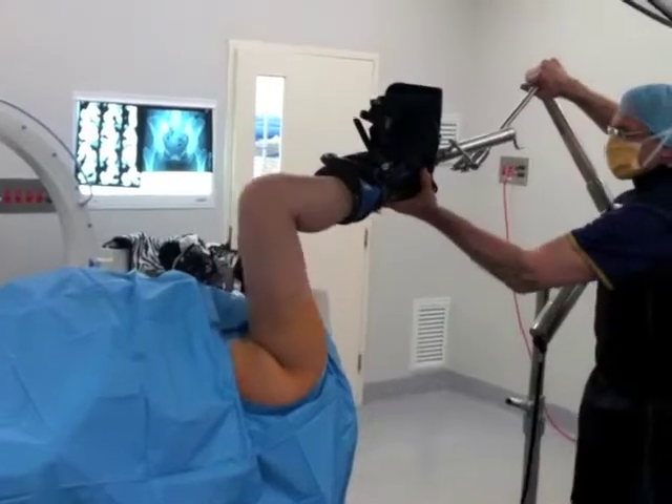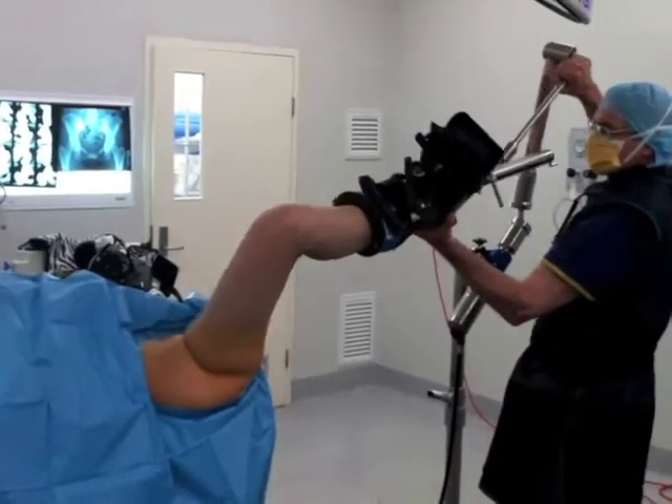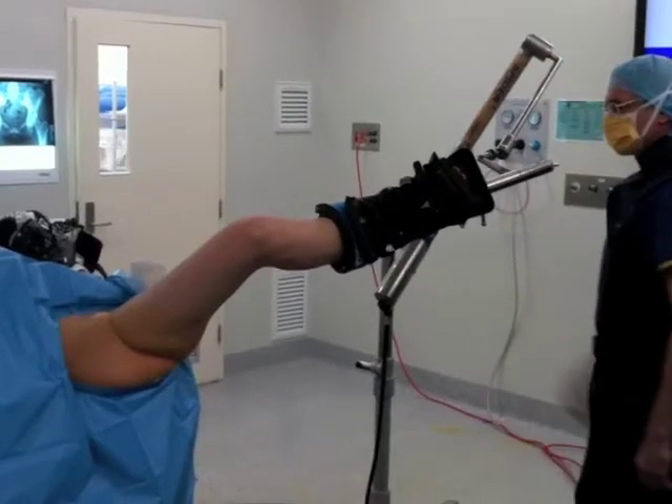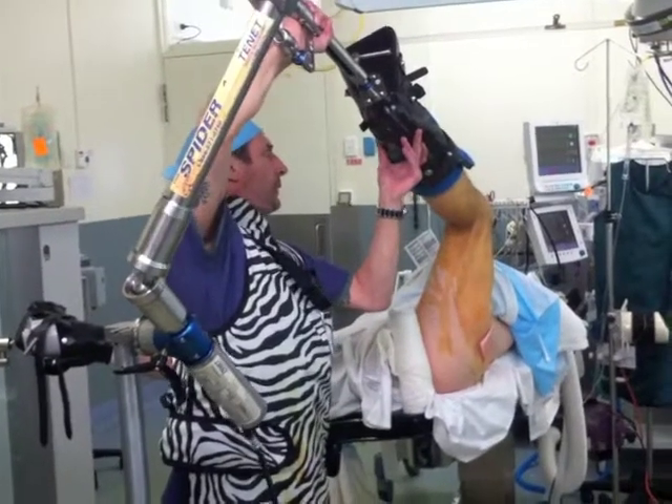The hip is brought into flexion, abduction and external rotation. The figure 4 position is very comfortable for anterior and inferior peripheral compartment cam work.